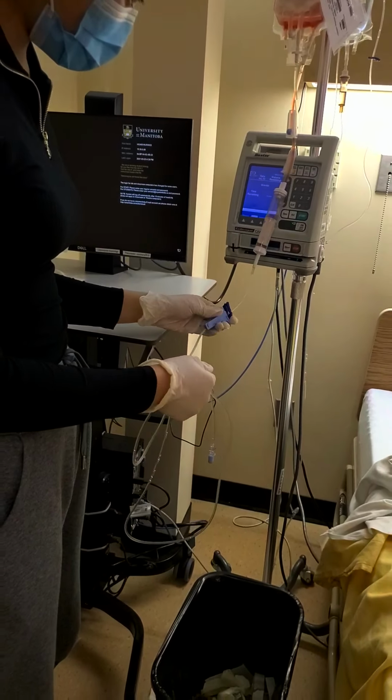You can see it's moving down there. I'm going to clear the lines. I'm going to stop the line for 30 seconds so it can start completing. Okay. And there you go. We can see a little bit of pink at the end there.